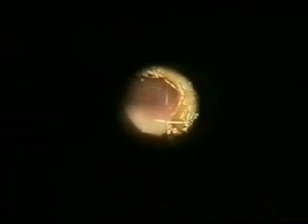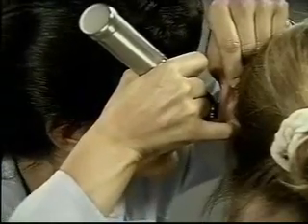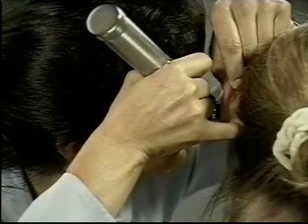Note any cerumen or earwax that may impair your view. Also observe for any discharge, foreign bodies, redness, swelling, or scaling. There should be none. Slide the speculum slightly down and forward and maneuver it until you can see as much of the eardrum as possible, including the pars flaccida if possible, and the margins of the pars tensa. Note the color and contour of the eardrum with its distinct cone of light.